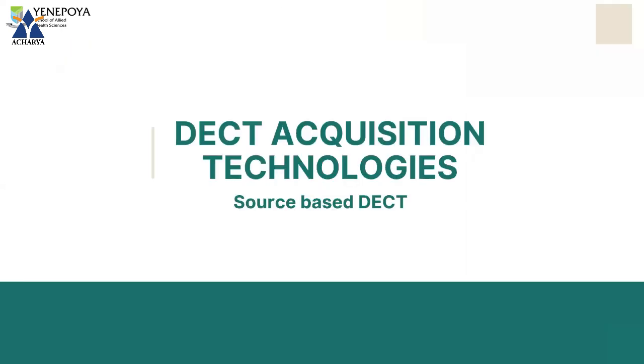Let's go to acquisition technology. As we all know, spectral imaging, which you also call dual energy CT, was one of the very first generation of spectral imaging scanners. If you divide the types of dual energy CT, you can divide it between source-based dual energy CT and detector-based. First, we will look into source-based CT.